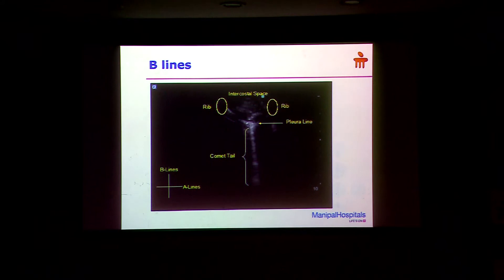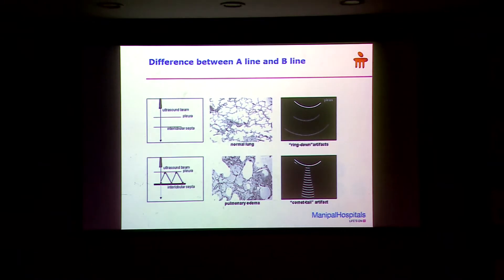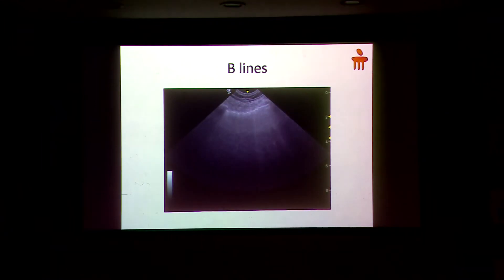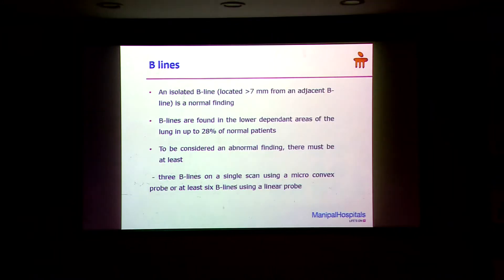A B-line goes from the pleura to the end of the screen. A-lines, as I said, happen in the normal lung when there is no fluid at all. When there is fluid, there is a reverberation artifact because of air and water interaction, and then you start getting B-lines. You can see some B-lines here — lines going from the pleura downward, moving with inspiration and expiration. They are B-lines.